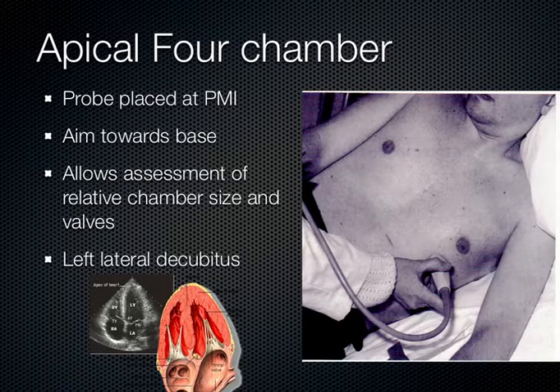Now patients who have chronic obstructive pulmonary disease or who smoke a lot, they lose that PMI, it goes away because their lungs expand to fill that little space. And so smokers, this is a very difficult window to obtain in patients who smoke or have chronic obstructive pulmonary disease or COPD. But this next week with your models, you'll see none of them do that, so they all have really good PMIs. And so this is a pretty easy window to get, hopefully next week.